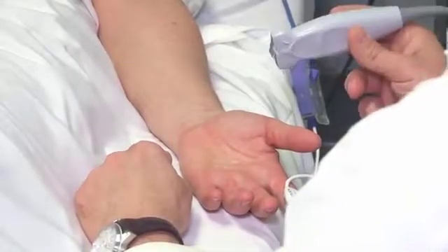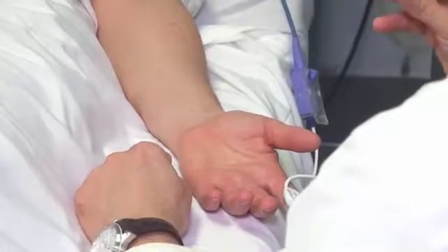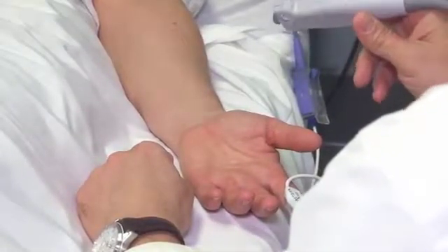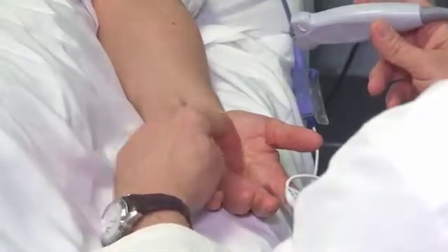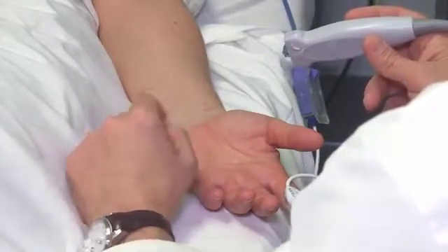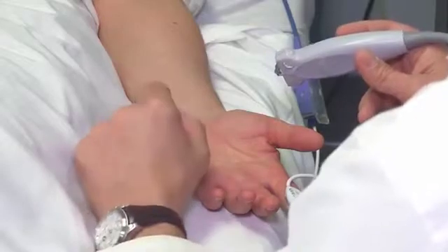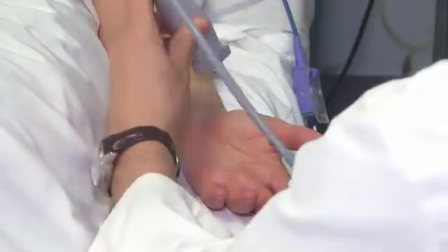I would like to evaluate your radial artery to see the diameter and patency. Even if you had a positive Allen's test and Barbeau test — showing that you have a patent arch in your hand — that doesn't mean you are a good candidate yet. What we still need to do is check the patency and the size of the radial artery, and that's what I'd like to do now.